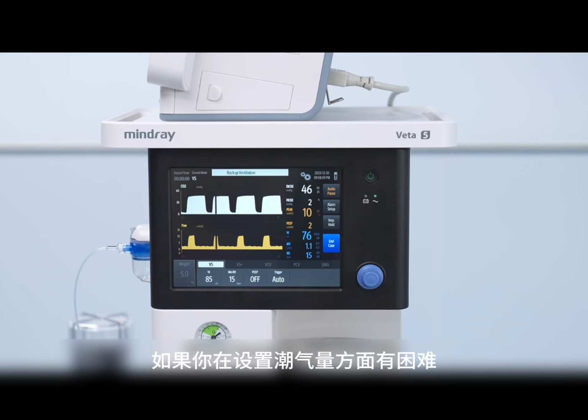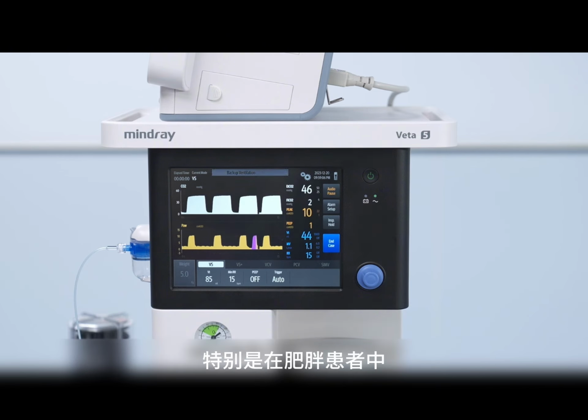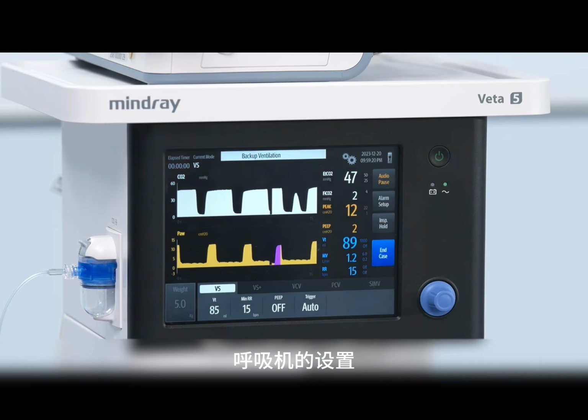Also, if you have difficulties with setting the tidal volume, especially in an obese patient, keep in mind that the tidal volume needs to be calculated for the lean body weight. The ventilator settings can be very complex and it needs experience.